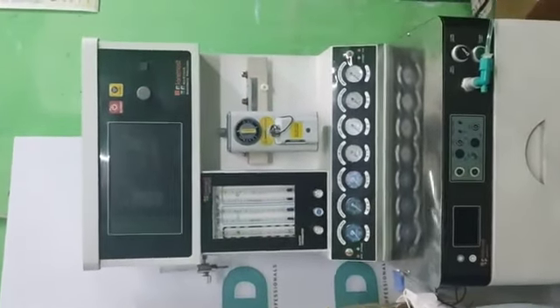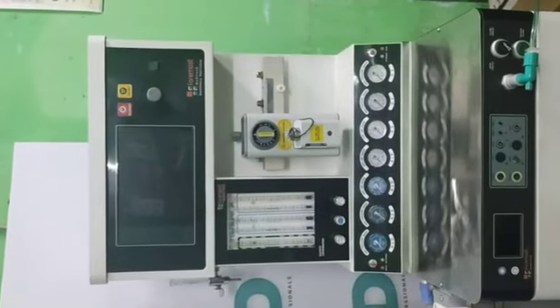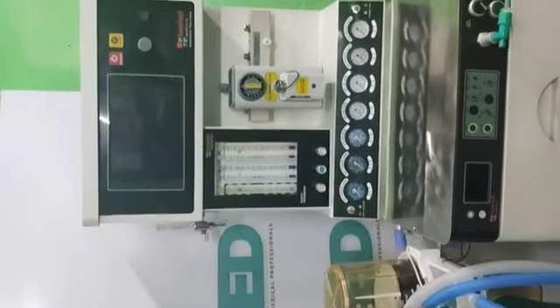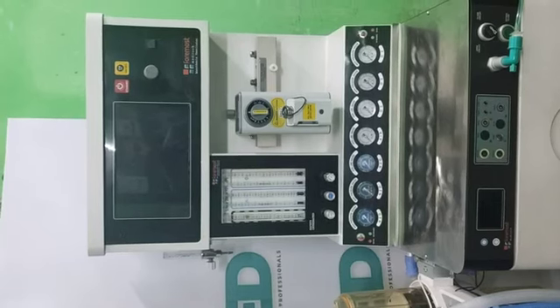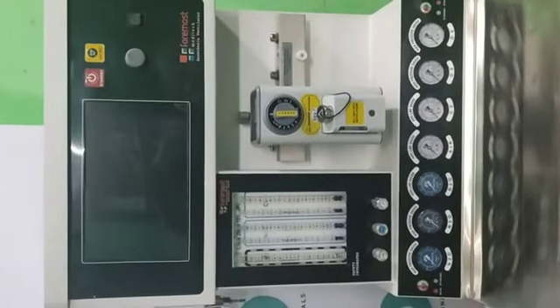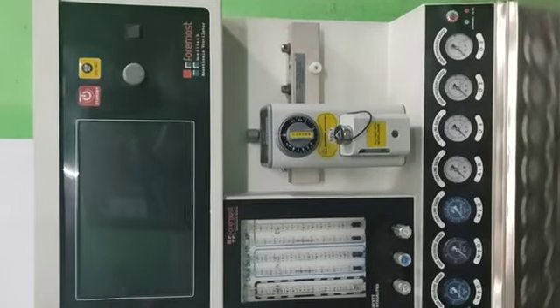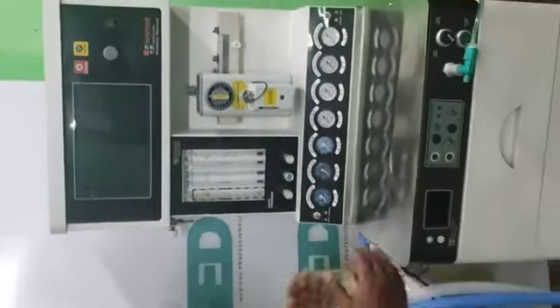Because an anesthesia workstation includes a ventilator, which ensures the exact delivery of air volume or mixing of gas, so that the patient will receive the exact amount of air the patient requires as per the patient's lung condition. It will help the respiration of the patients very well, so that the comeback time of the patient is very short.